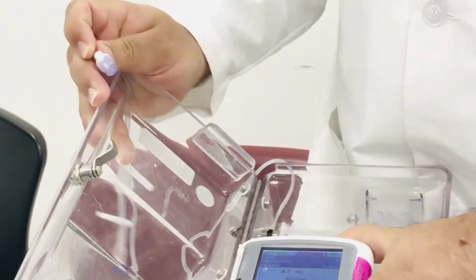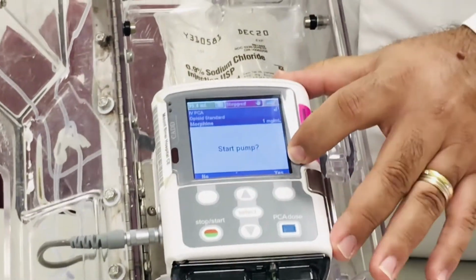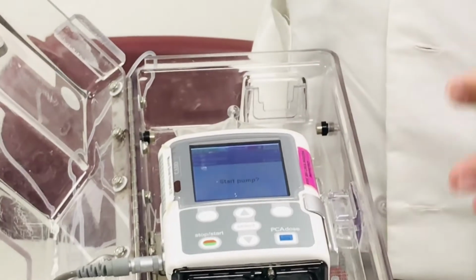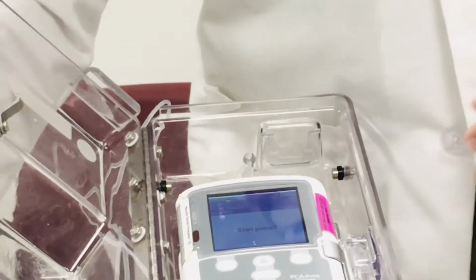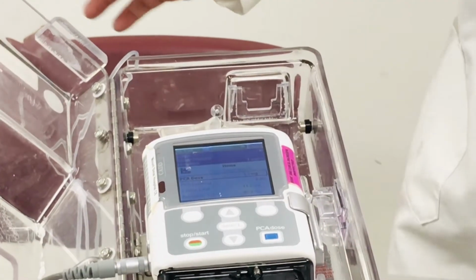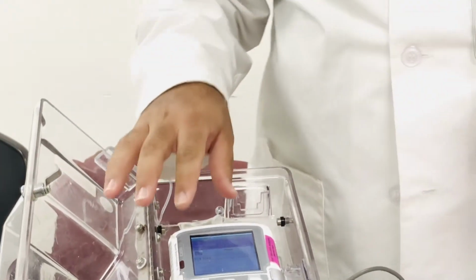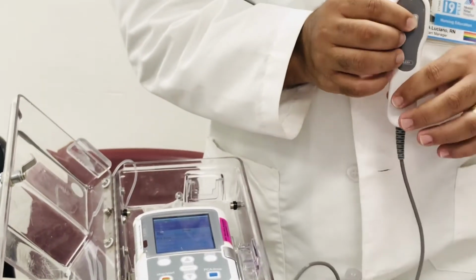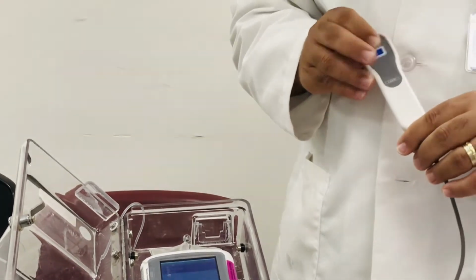It's gonna ask you if you want to continue priming. If you say no, the next thing it's gonna tell you is to start the pump. Ensure that you are connected to the Y line, the closest line to the patient, and you connect this to the patient. When you start the pump, it's going to tell you, you know it's correct because most likely it will ask you to press the button or there will be a green light. So that's how you set up a pump.